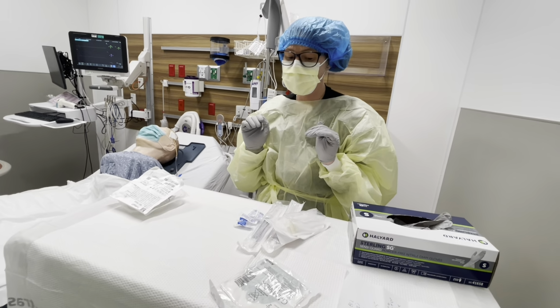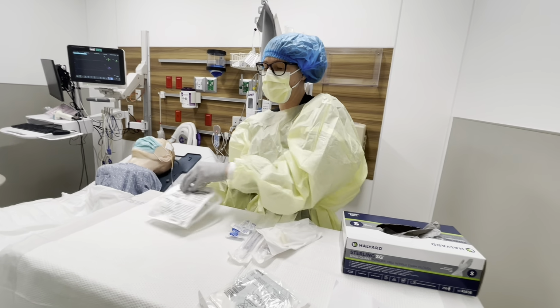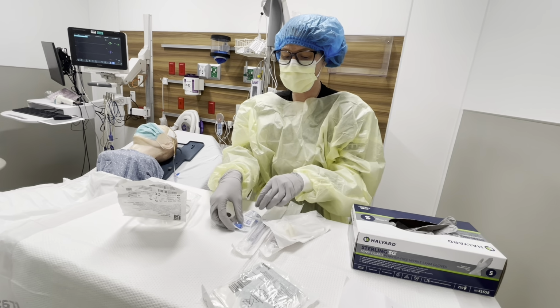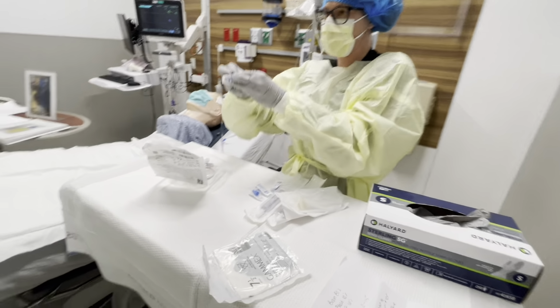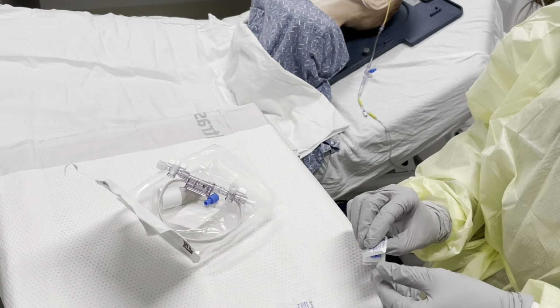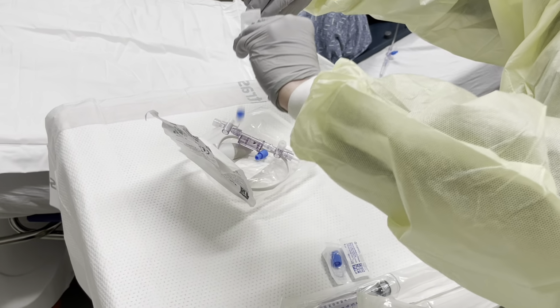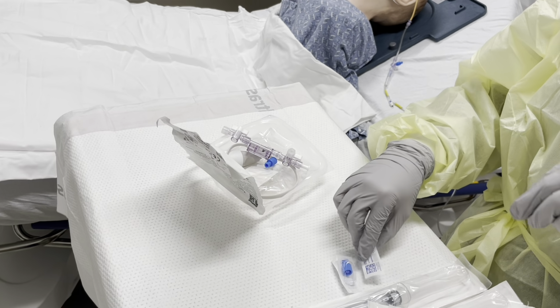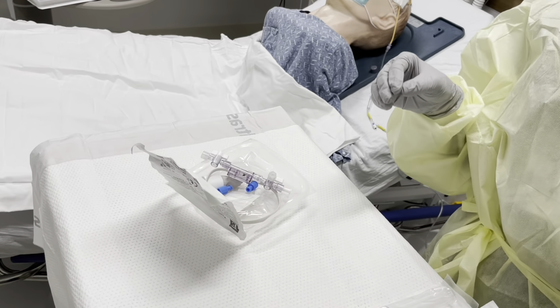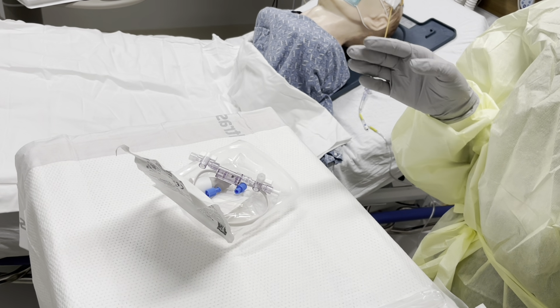The next thing I'm gonna do while that is air drying is I'm gonna start opening some of my sterile packaging. So I will open my sterile packaging, okay? I will open my little blue caps, and I will put them in. Again, I'm still clean at this point. I'm trying to touch nothing. Drop them in. Oh, that one's gone. Drop them in.